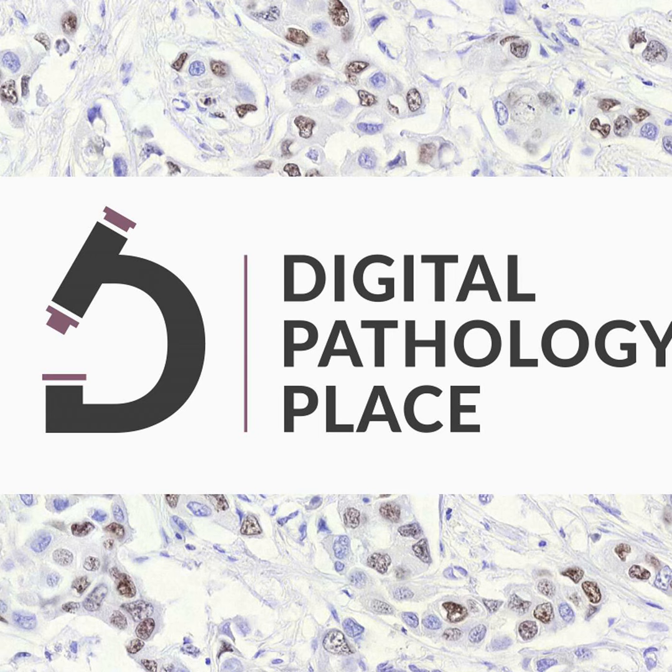C. The quality and faithfulness of digital replicas. Although WSI does not yield an exact copy of the glass slide due to inherent scanning limitations, the FDA assures that when WSI include all the elements from glass slides needed for histopathological evaluation, they are adequate for pathology report generation. And when they do include all those elements, they are referred to as faithful digital replicas.